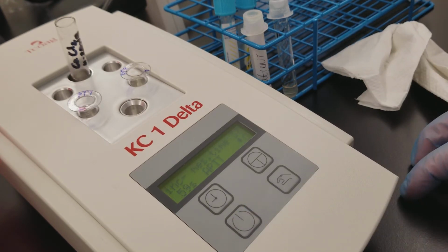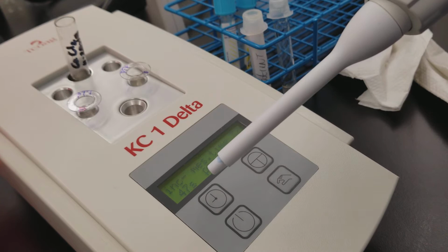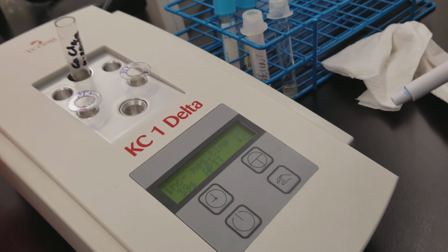All right. And it's going to start the incubation time of the reagent being in there with the specimen. What's going to end up happening is once it gets down to zero, it's going to beep at you. Don't let that startle you or get you upset. It's just trying to let you know that the next things you do will possibly affect the accuracy of your patient's result in regard to how long it's been incubating. And again, like I said, the 5 to 6 minutes will have already been reached when you're ready. Okay, so we're getting down to that point.